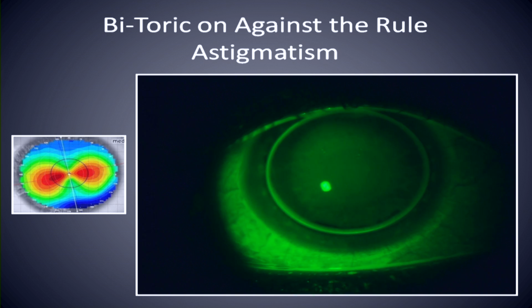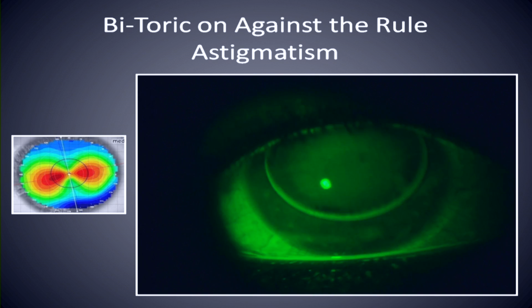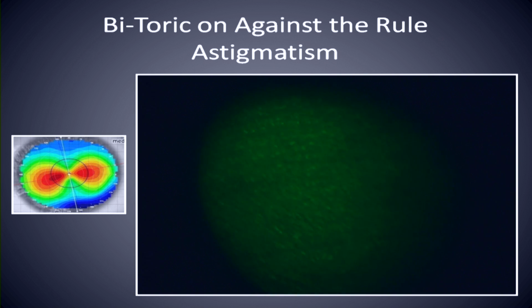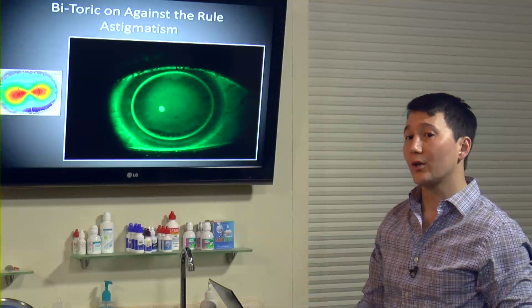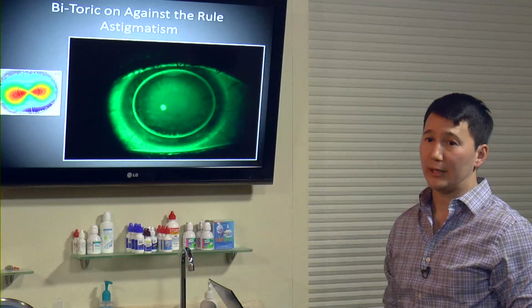Instead of having a lens that hits at 12 and 6 o'clock and only goes nasal and temporal, now we steepened up the horizontal meridian so it can only sit on these rails. It can only move in the vertical meridian. So a powerful tool for helping us to optimize the fit of the lens. Before we started, we knew that a spherical GP on this patient had no hope of being successful. We needed to go to bitoric.